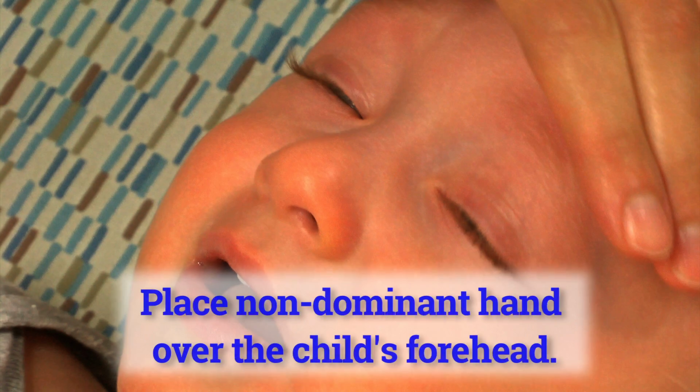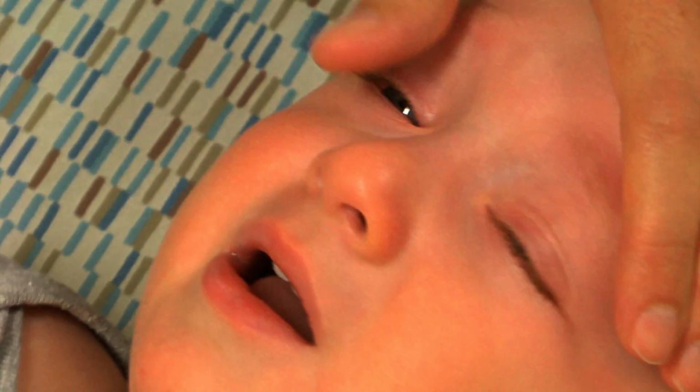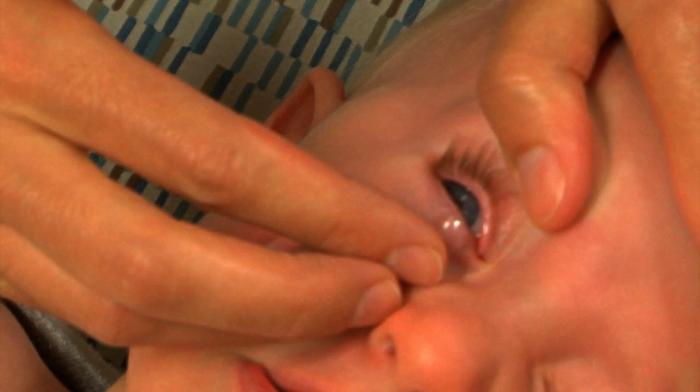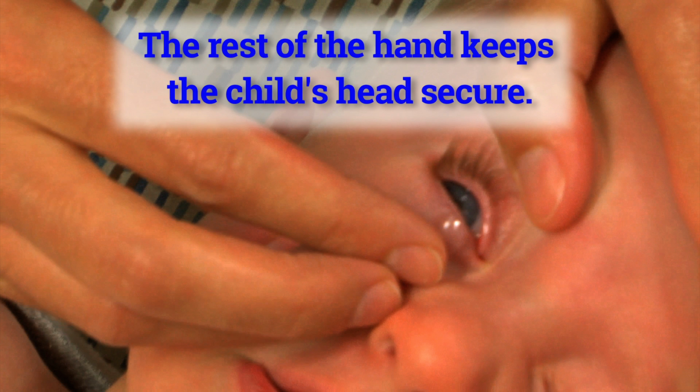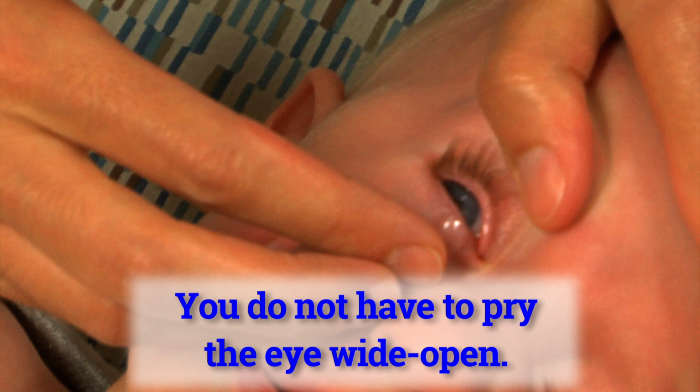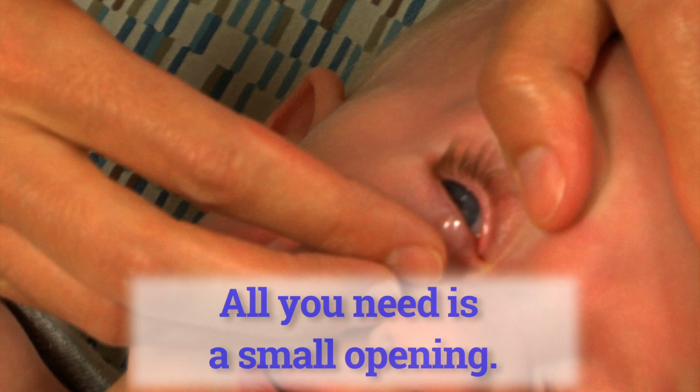With our clean hands, we first start with placing our non-dominant hand over the child's forehead. The thumb should be pulling up on the child's upper eyelid. The rest of the hand keeps the child's head secure. The reason why we have our hand here is to ensure that the child's head is steady while we are trying to insert the lens. You do not have to pry the child's eye wide open. All you need is a small opening or pocket.